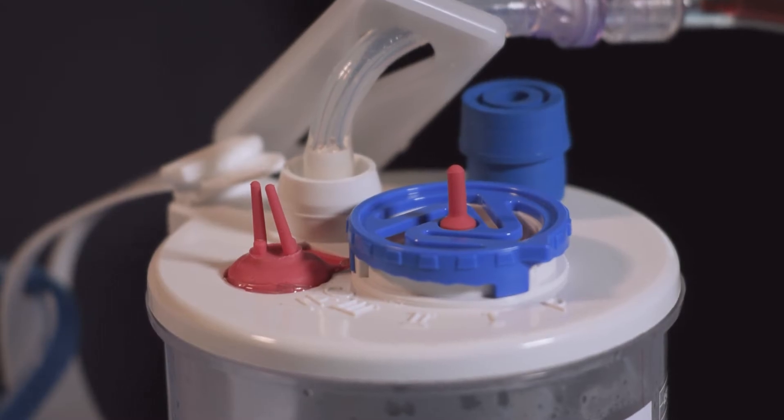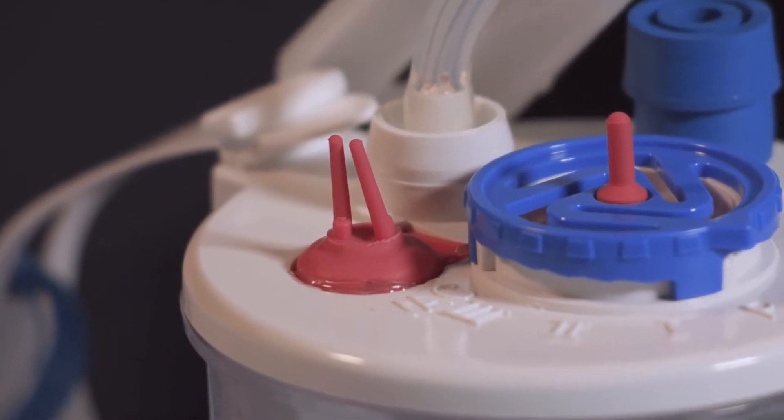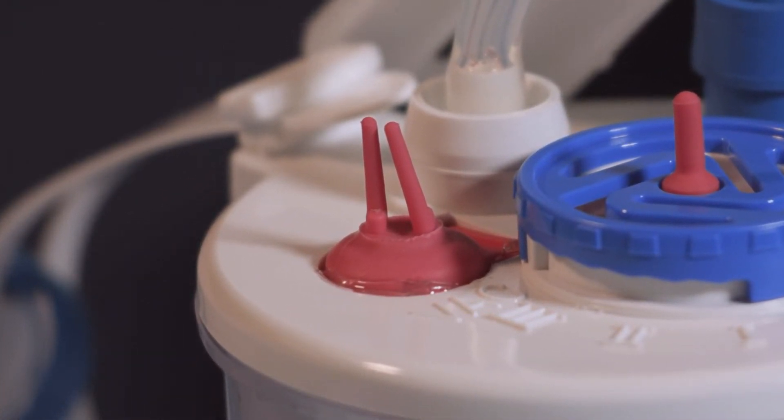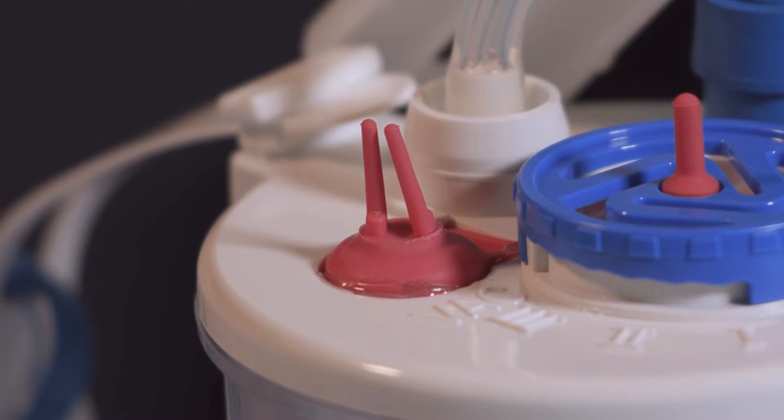If the vacuum indicator is not showing a tight V configuration, the canister needs to be re-vacuumed. This can be done at any time.